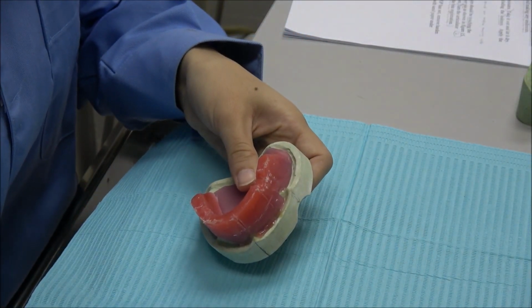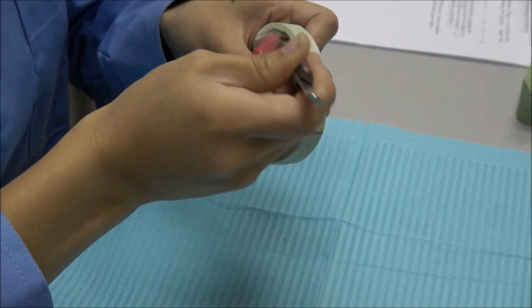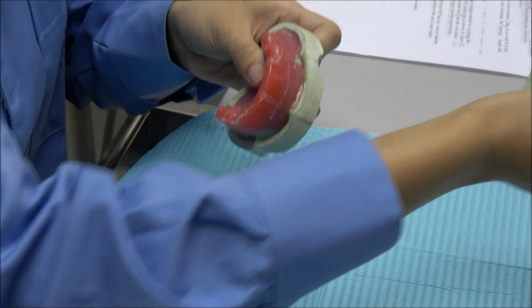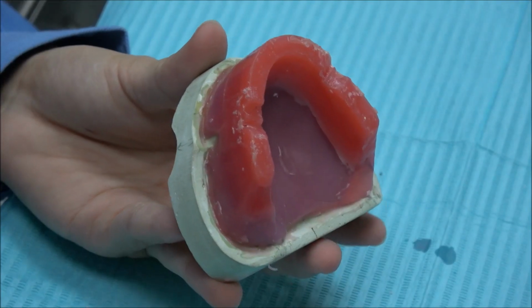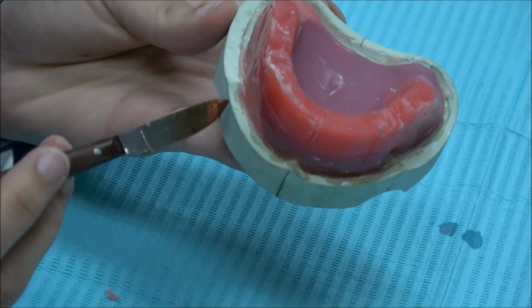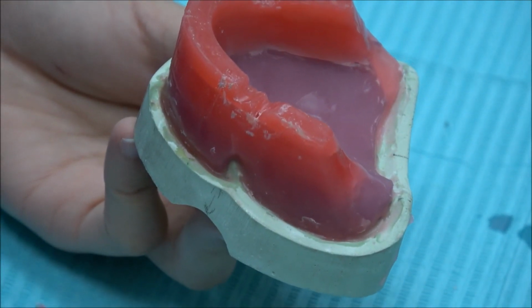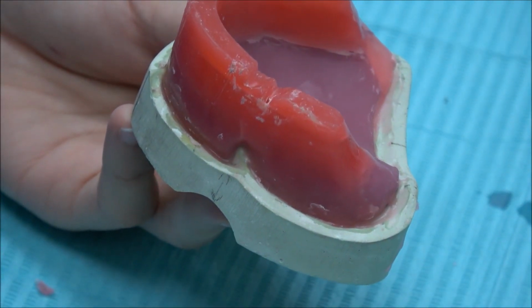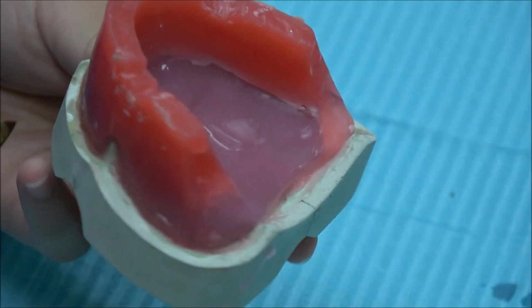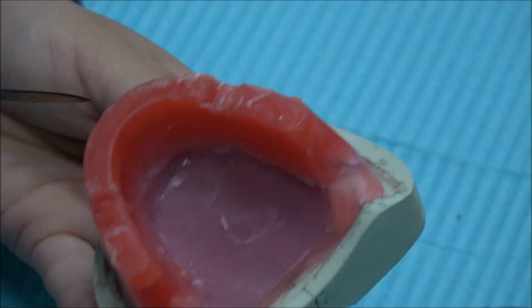Make sure the model really fits properly on the models. Make sure there is nothing in between. Make sure to seal around the sulcus area, seal around here, to make sure later on when we mount, we won't get any plaster, POP, anything inside our cast. So make sure you seal properly, seal around here. Can you see? Make sure it's sealed properly.